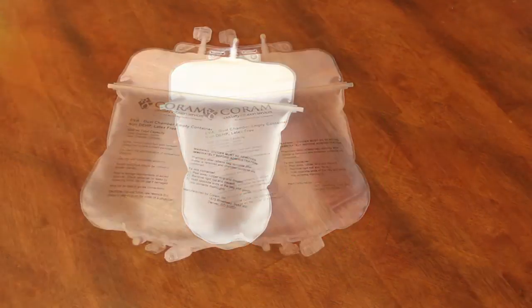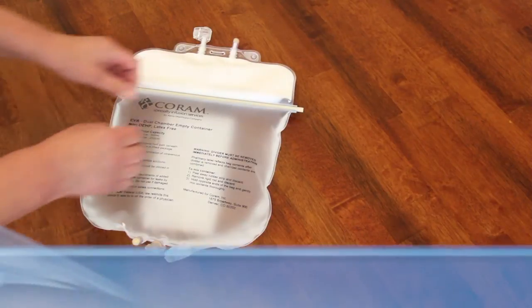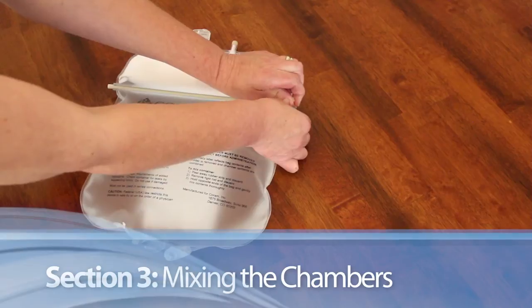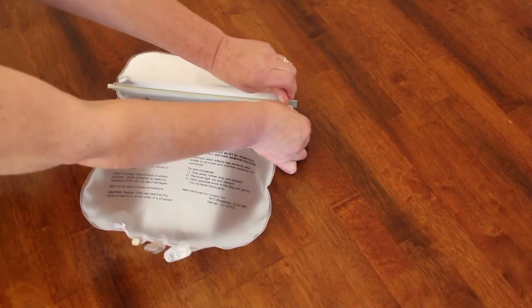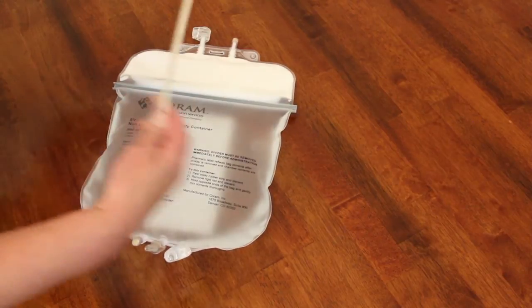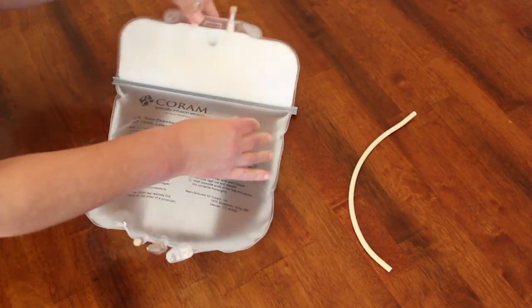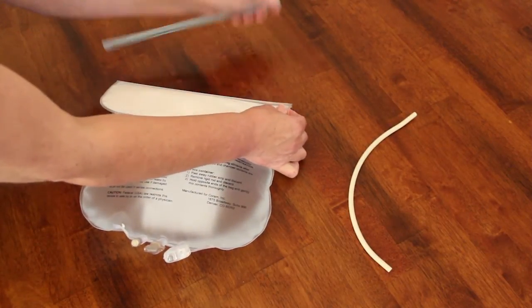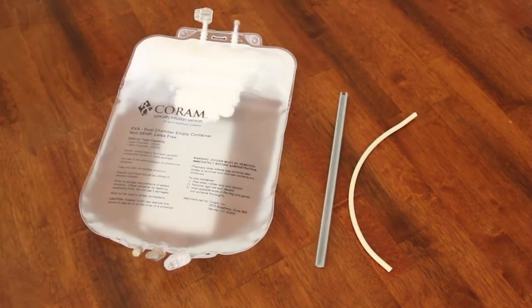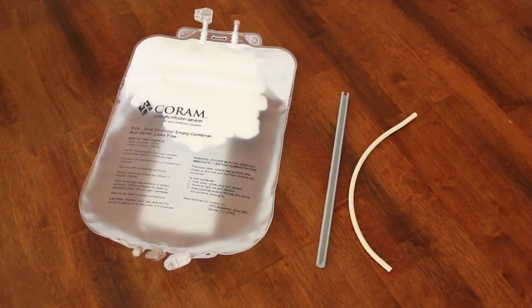Just before infusing your TPN, the dual chamber bag must be activated to allow the two chambers to mix. To activate the dual chamber bag, firmly grasp the end of the rubber strip that acts as a divider and pull or peel it away from the divider rod. The two chambers will now combine to become one bag. Discard the strip and the divider rod as directed.